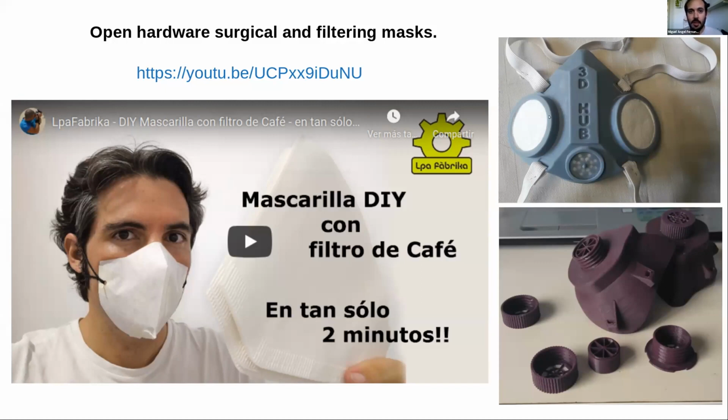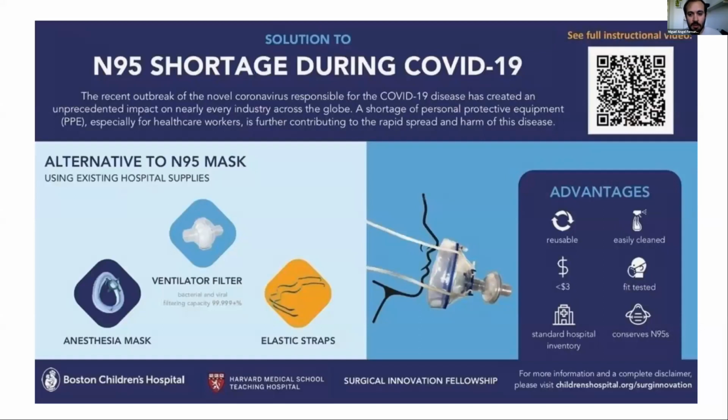So basically, as I was getting calls from hospitals that they were running out of masks, even in the ER room, I started to search for anything that I could make for them. Then I found a solution called the Boston model. It was developed in the Boston Children's Hospital, and it is basically the last resort that physicians in the ER room can use.